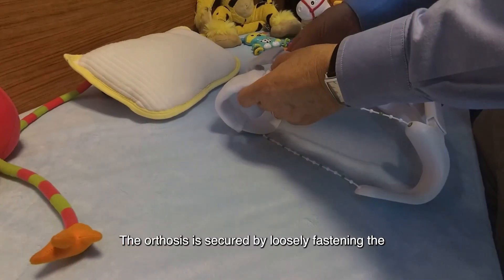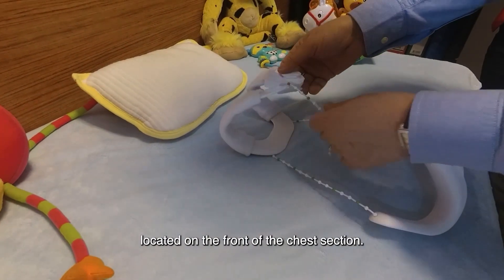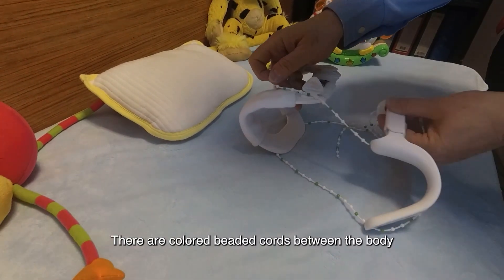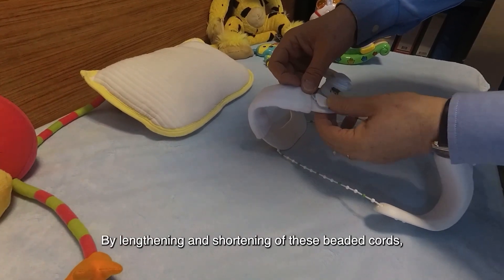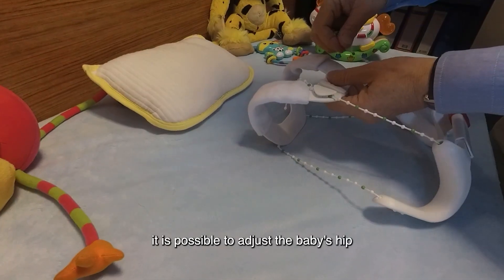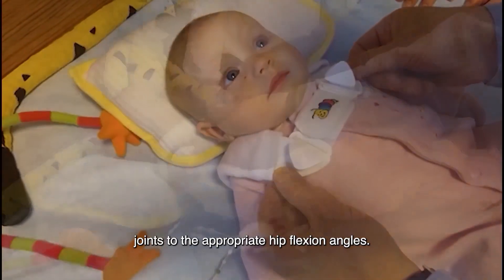The orthosis is secured by loosely fastening the hook and loop closure located on the front of the chest section. There are colored beaded cords between the body and leg sections of the orthosis. By lengthening and shortening these beaded cords, it is possible to adjust the baby's hip joints to the appropriate hip flexion angles.